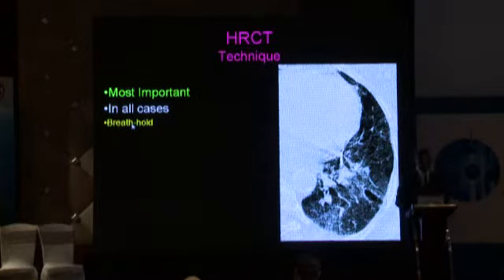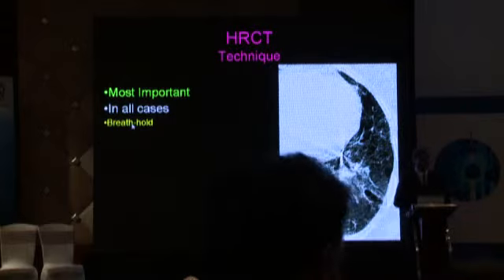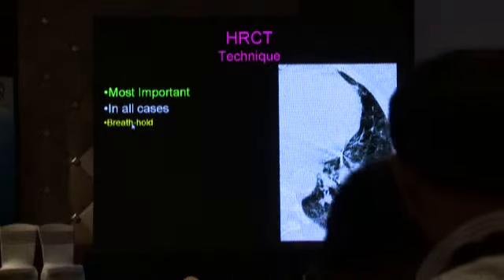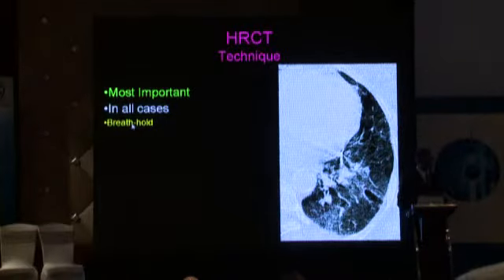Obtaining good quality images for the lungs is not rocket science. It does not require a 320 or a 256 slice scanner or a flash scanner. You can get great quality images on a conventional single slice scanner as well, because what we require is not scanner dependent, but is really dependent upon patient training.